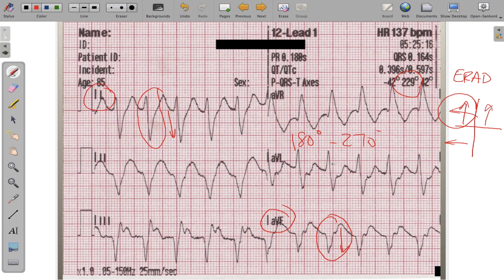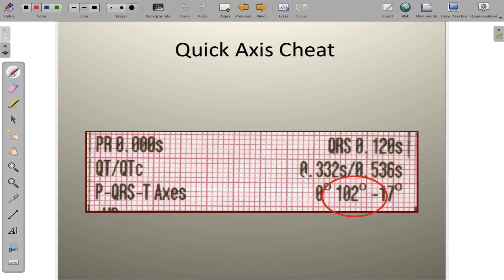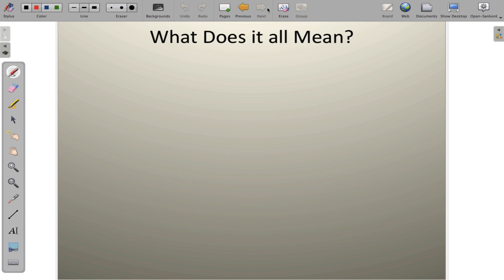A quick cheat on every 12-lead EKG: look for the P, QRS, and T axis line at the bottom of the printout. The middle number gives you the QRS axis calculated by the machine. Remember, this middle number specifically reflects ventricular depolarization. Use this to cross-check your quadrant method assessment quickly.